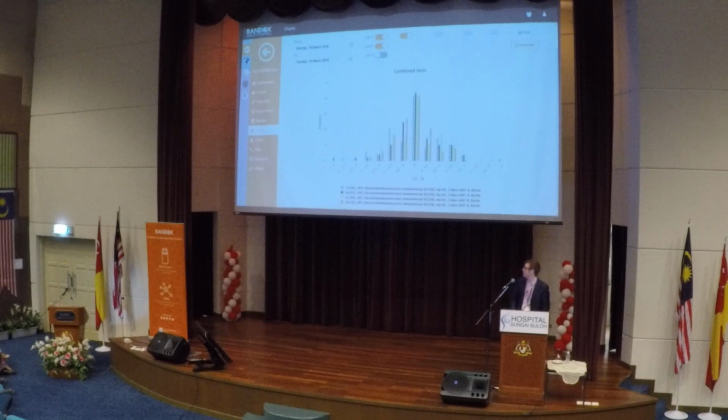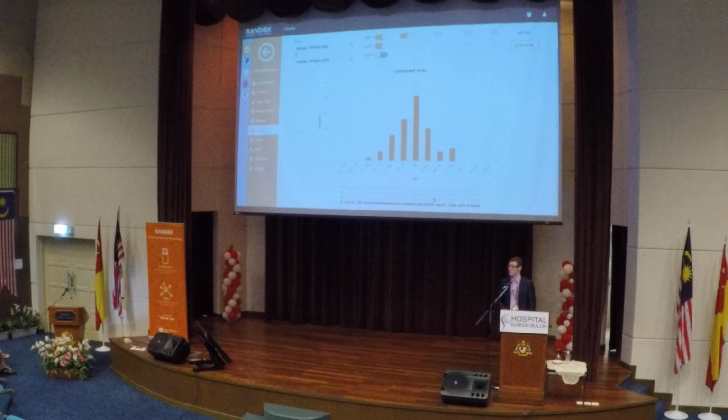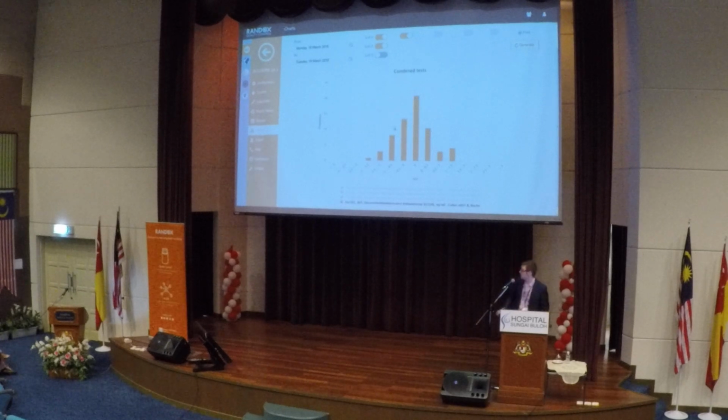What we want to see from this graph is just a normal Gaussian distribution, with most of our results and our highest bars falling in and around the 0 mark. So let's look at each of these lots one by one and see if we can identify any performance issues. We'll turn everything off except for this orange test. Our results are pretty even above and below the mean. Maybe the bars are slightly higher on the negative side, so that might mean we have an ever so slight negative bias, but it doesn't look like anything to be too concerned about just yet.